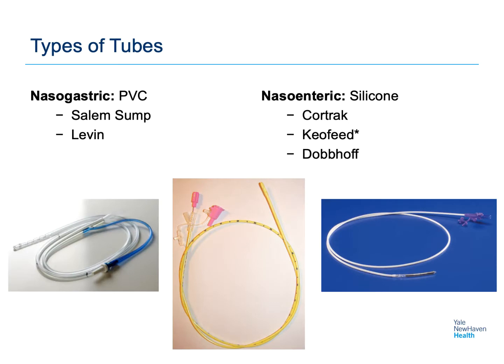On this slide, I have highlighted some of the different types of tubes and would like to just go over some of the nomenclature, because this can be one of the confusing parts of being on the wards in the hospital. A lot of people will refer to things using brand names versus types of tubes, and I just wanted to clear up some of that nomenclature that we use in the hospital.